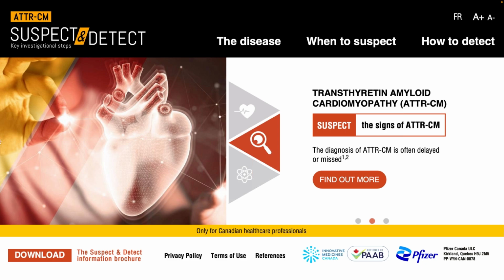Yeah, great question. It is an area of active research interest. I think your project together with Vassner and Geraldine, they are looking at that. The atrial function assessment is not necessarily built into our machine. So right now it's not that easy to do them both with the echo machine or with the echo pack that we use right now. We have to actually download to a research system to be able to do that offline.